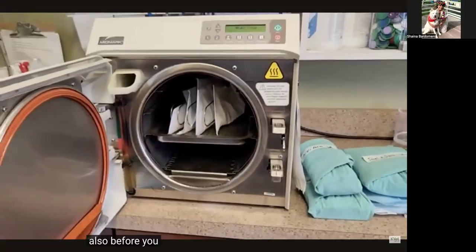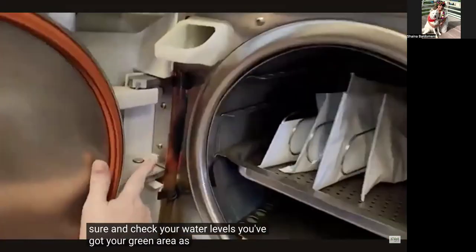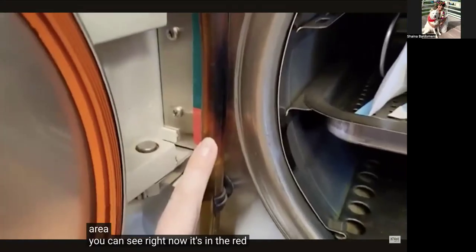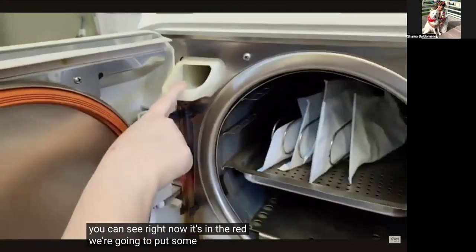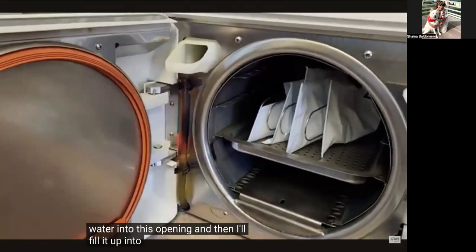Also, before you run it, you want to make sure and check your water levels. You've got your green area as well as your red area. As you can see right now, it's in the red. So we're going to put some more distilled water into this opening, and then I'll fill it up into the green.